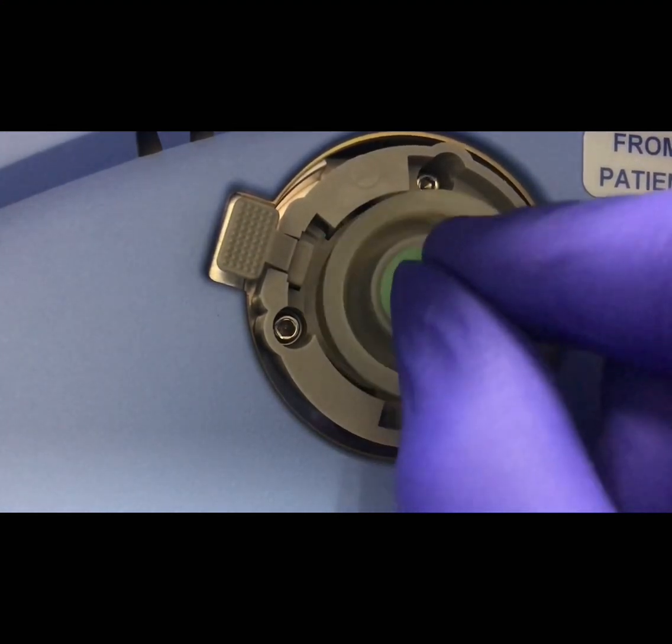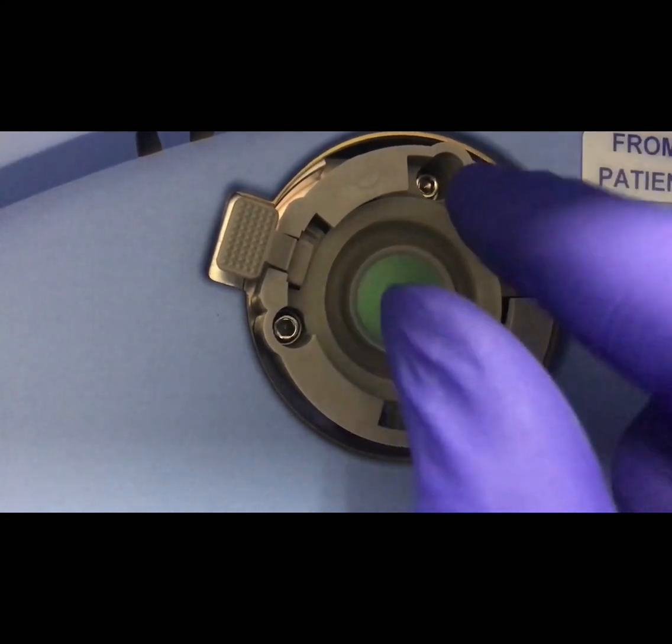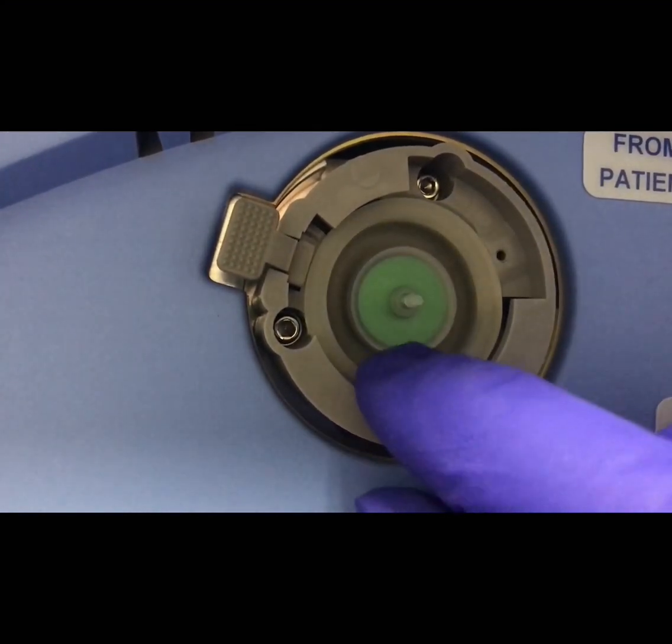We'll begin by attaching the exhalation diaphragm to the ventilator, being careful that it's fully seated all the way around.